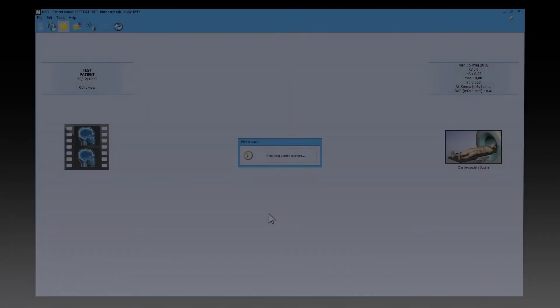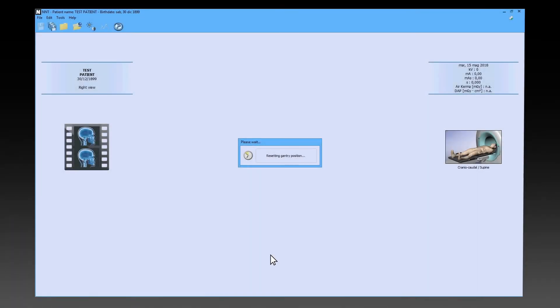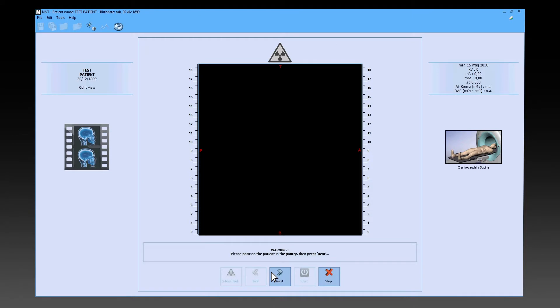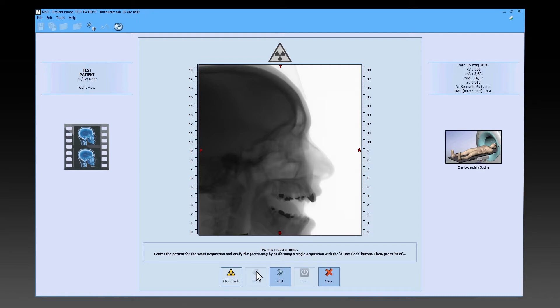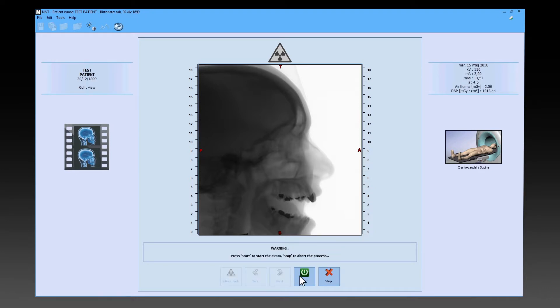After going back to the console, the physician hits next and, using the X-ray flash button, obtains the first scout image. Without any further adjustments, by pressing next you will perform the scan.